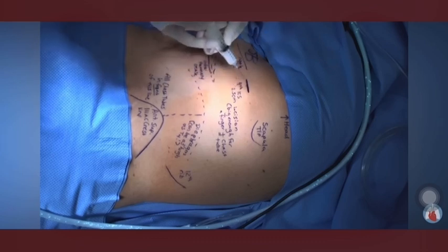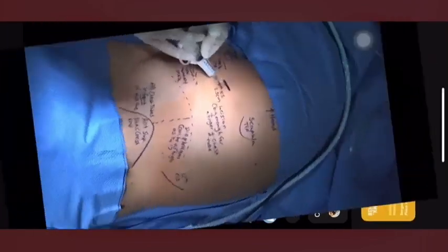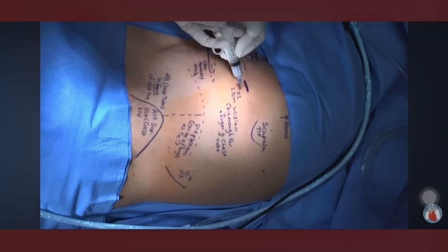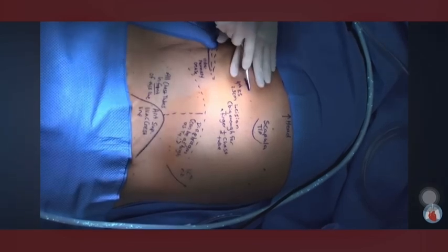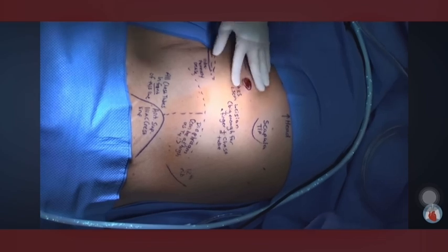Skin must be anesthetized and allow adequate time for the medication to take effect. As dissection is carried down to the chest wall, each layer should be anesthetized, followed by the pleura again, allowing time after each step for the local to take effect. Have all 30 mLs drawn up ahead of time and ready to use. In particularly deep patients, a Kelly clamp can be used to help identify the path the needle needs to follow.